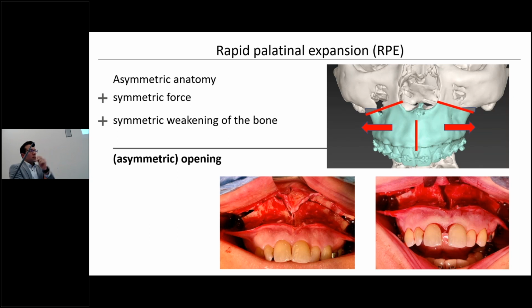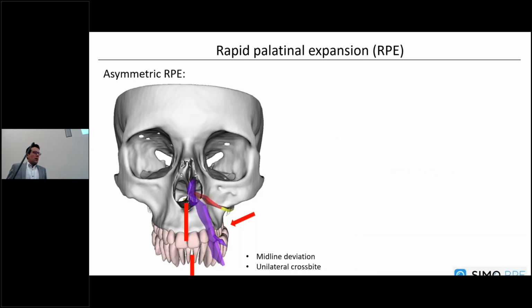That's why we take these small wedges within the maxilla on the lateral side out, so that they really can drift apart. And intraoperatively, by simply activating the distractor a little bit, we just check that a certain symmetry is there, so the osteotomy is loose enough. But sometimes we've got special cases.